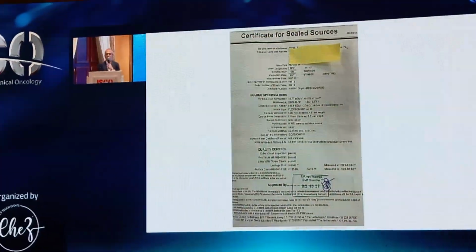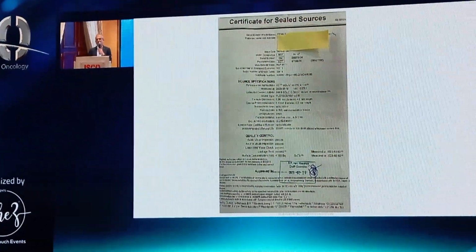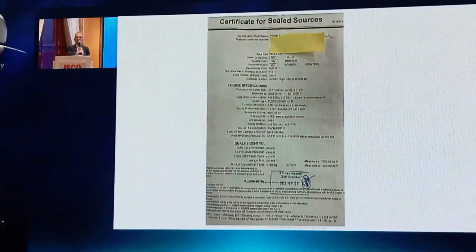Another question might arise: everything is okay, but that much expense for that ionization chamber and time, just give me a break. These companies are sending a calibration certificate, correct? Why should I calibrate? Do I know better than them? They send it, it's there. You pay, they send the calibration. You have the values inside the planning system.